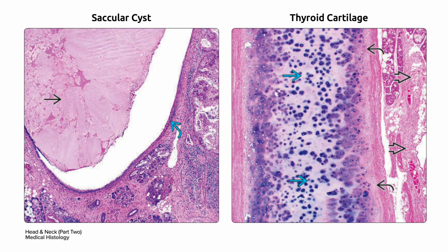On your left are saccular cysts. They represent the cystic dilation of your laryngeal saccule. They present in the supraglottis and histologically are respiratory epithelium lined cysts in curved blue arrow. They contain mucin in single black arrow. They usually result from obstruction by invasive squamous cell carcinomas.